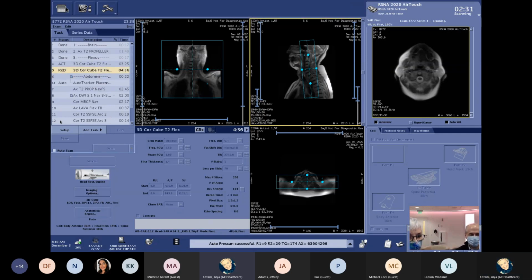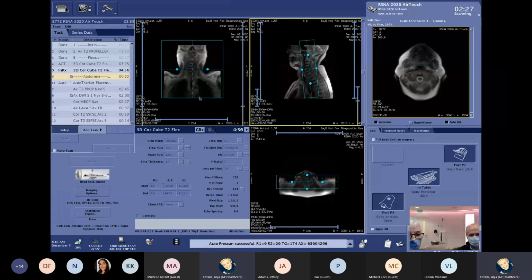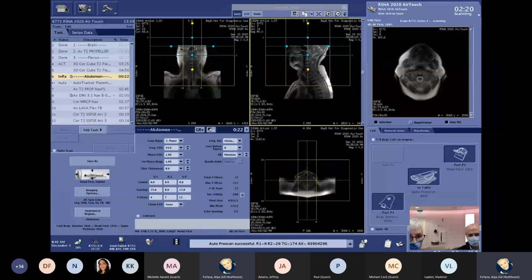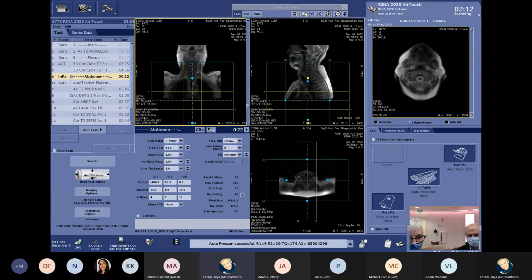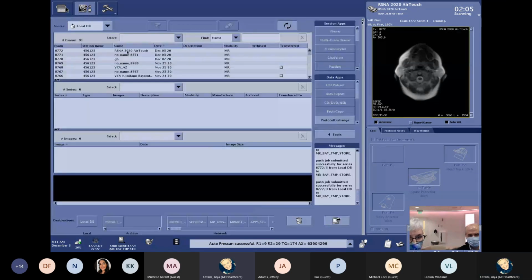Okay. So then we just go down, and we will continue with our free breathing liver. Therefore, I just want to find the liver. So I go ahead and prescribe my localizer where I hope the liver will be. Okay, that's where we go. And then we can already look at the first images acquired in the brain.